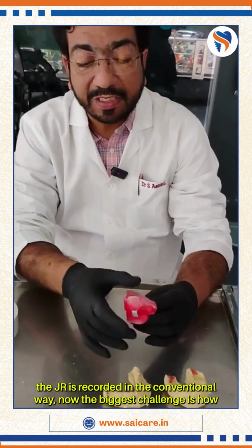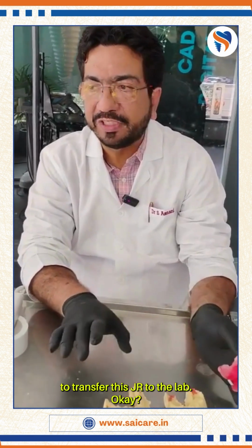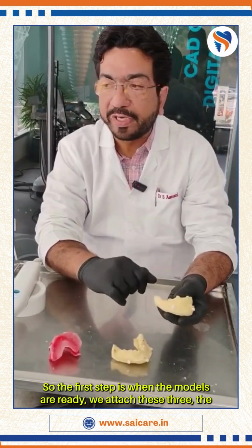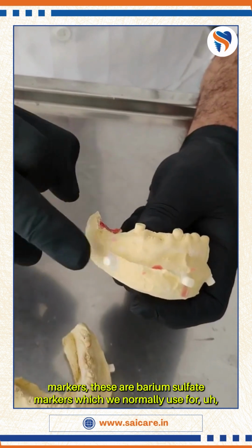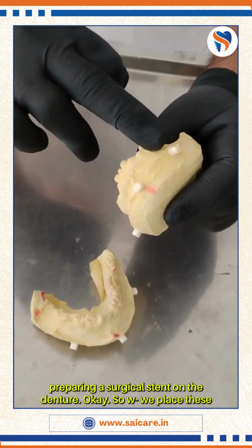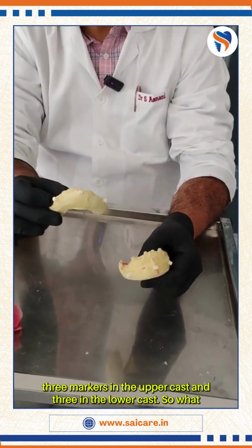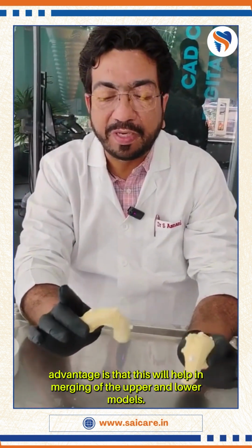So once the JR is recorded in the conventional way, the biggest challenge is how to transfer this JR to the lab. So we'll see one by one the steps which we follow. The first step is, when the models are ready, we attach these markers. These are barium sulfate markers which we normally use for preparing a surgical stent on the denture. We place 3 markers in the upper cast and 3 in the lower cast. The advantage is that this will help in merging the upper and lower models.